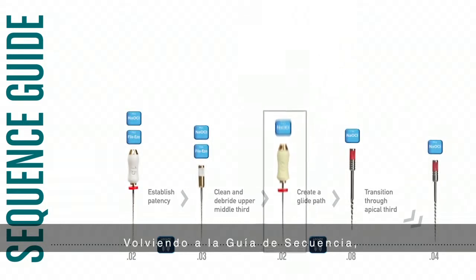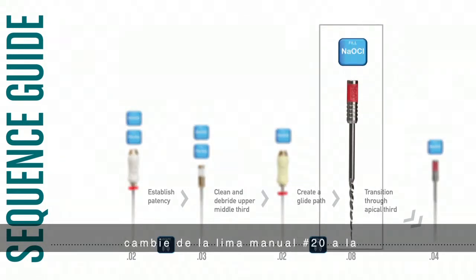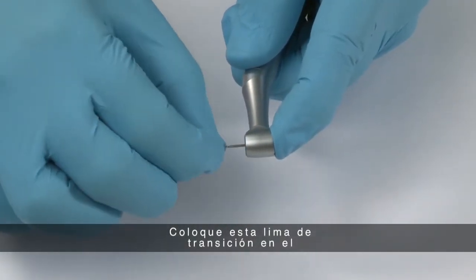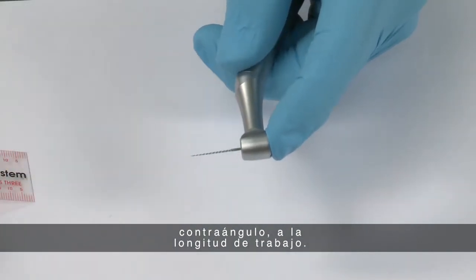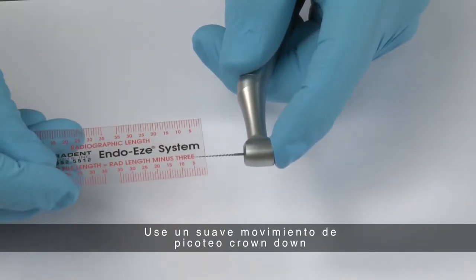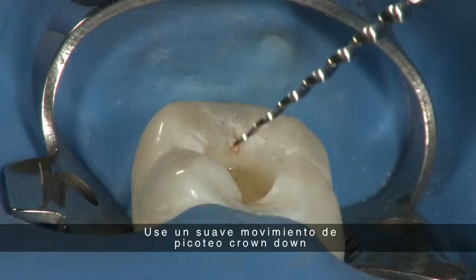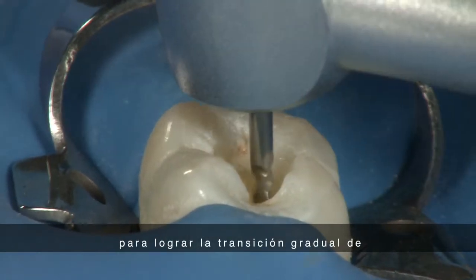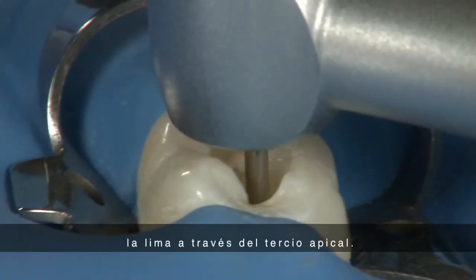Back to the sequence guide, change from the number 20 hand file to the 0.08 taper transitional file. Place the 0.08 taper NiTi transitional file into the contraangle and set it to working length. Use a gentle, pecking crown down motion to gradually transition the file through the apical third.